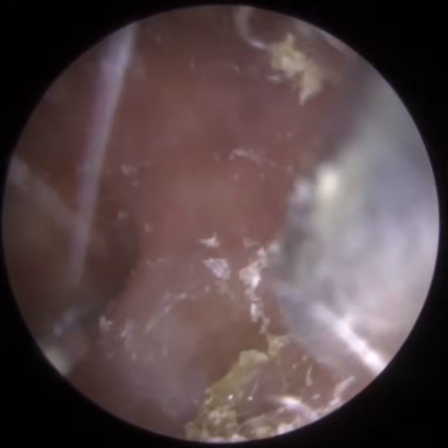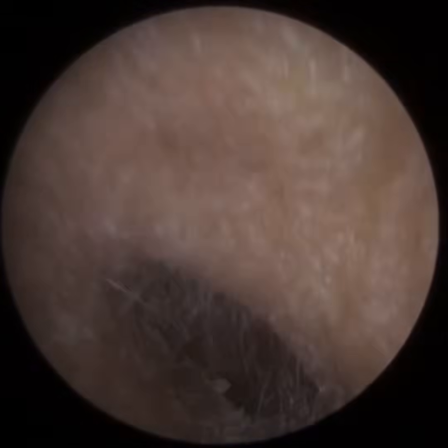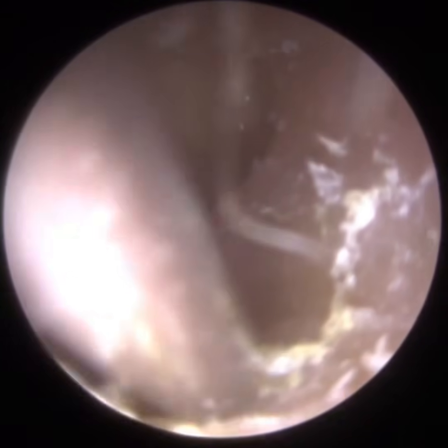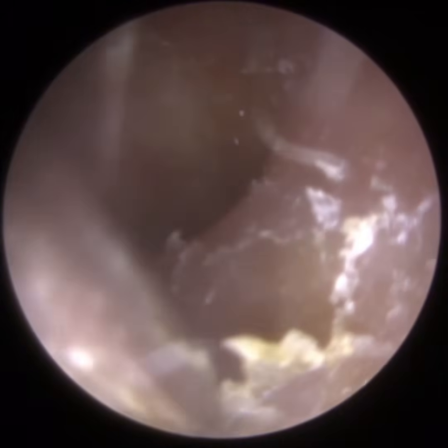And when we're on the outer part of the ear canal, the cartilaginous part, the skin is a lot thicker, so we can put a bit more pressure on there. It's less sensitive for the patient when we do. You can just see the ear canal, how it goes upwards, the inclination. It goes up, then it goes down, so it's almost like a ski slope. It goes up and then suddenly down. It's just some more skin that we're peeling gently.